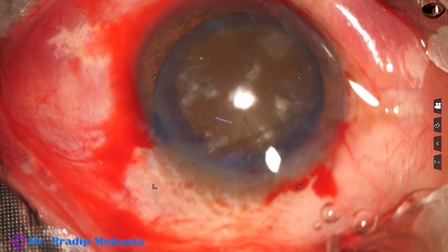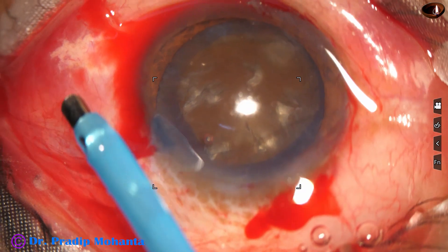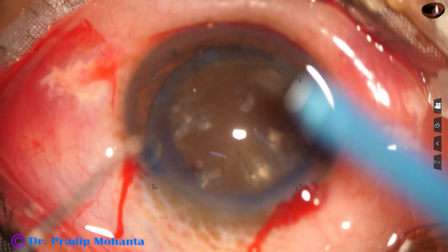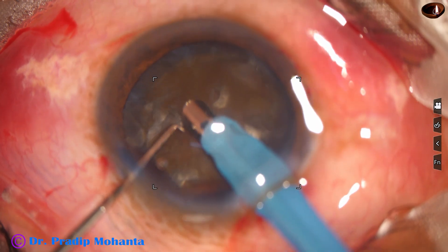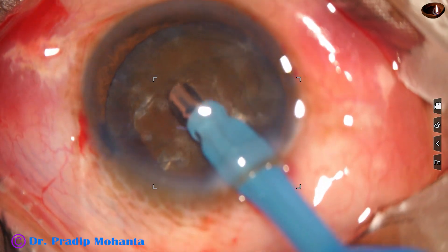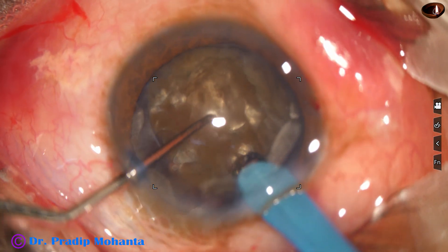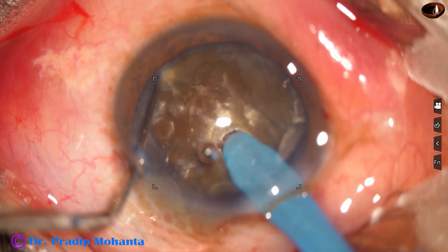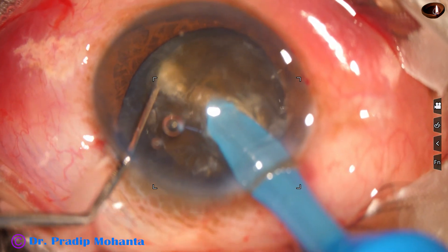Now is the time to go into the anterior chamber with the phaco needle. I am increasing the exposed part of the tip, and now I am going to do the submarine technique — the technique I have developed over the years for dividing such hard cataracts. Some superficial lens matter is removed so that we can judge how deep we are going. We can see the tip as it goes through the substance of the nucleus, near the opposite equator, and stops there.